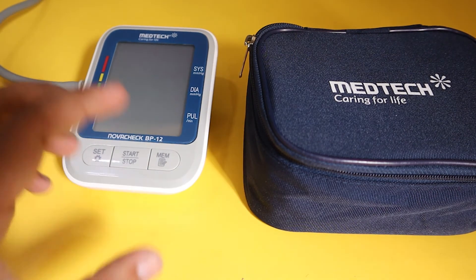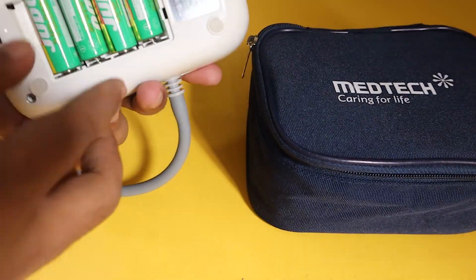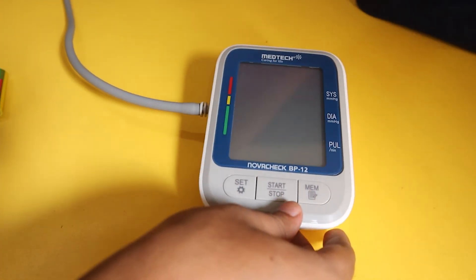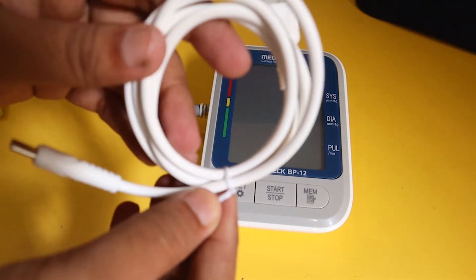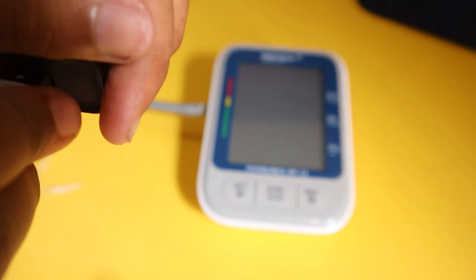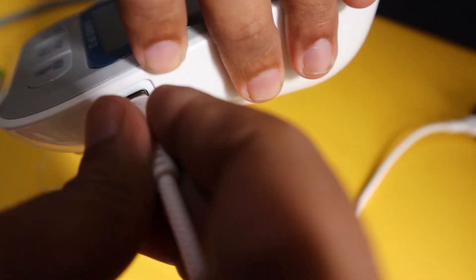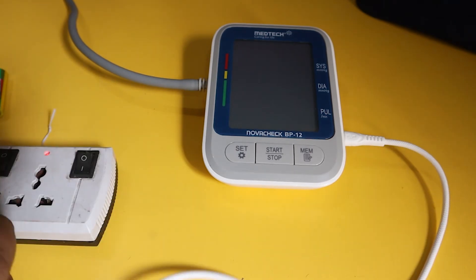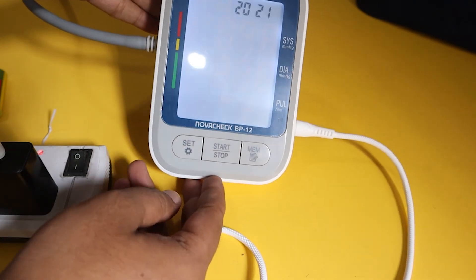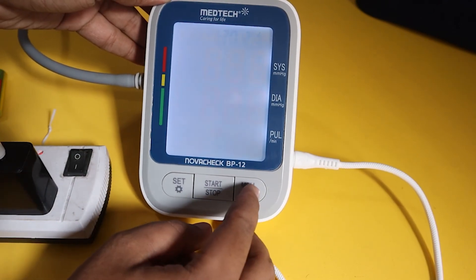I forgot to show you one more thing — the main USB feature of this device. That is, you can use this device without any batteries. I'll remove them and attach the USB Type-C cable to an AC power adapter — make sure to use a normal adapter, no fast chargers, which might damage the device. Connect the Type-C end to the machine's port and then connect it to a power source. You can see it's working directly from the AC power source. This is a great feature — it's not always possible to carry batteries, so in that case this feature will come in handy.